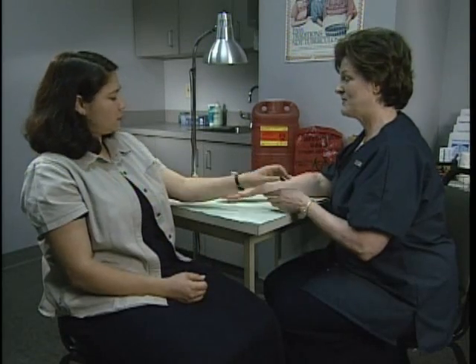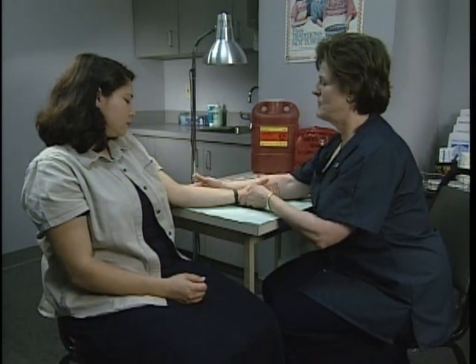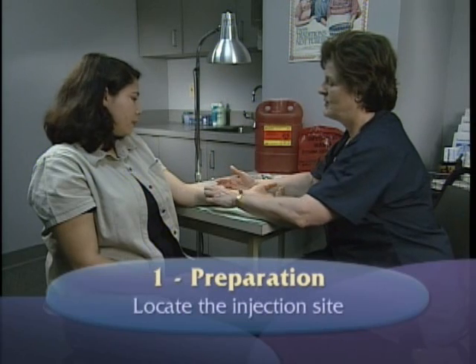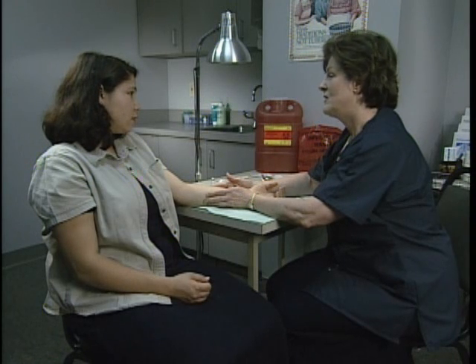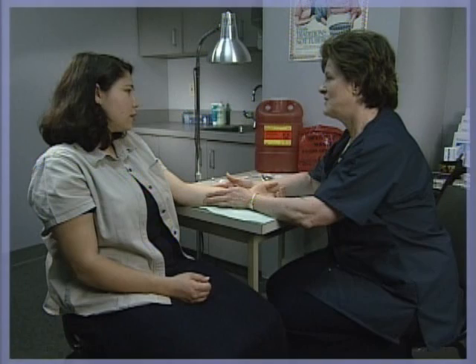On a firm, well-lit surface, expose the patient's arm and slightly flex it at the elbow. The injection should be placed on the palm side-up surface of the forearm, about 2 to 4 inches below the elbow. Your local institutional policy may specify the right or the left forearm for the skin test.